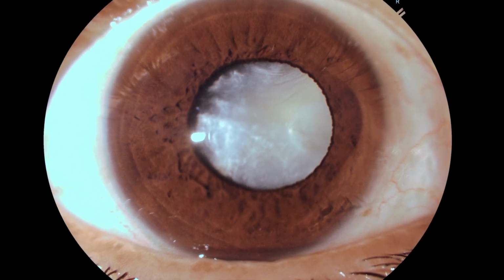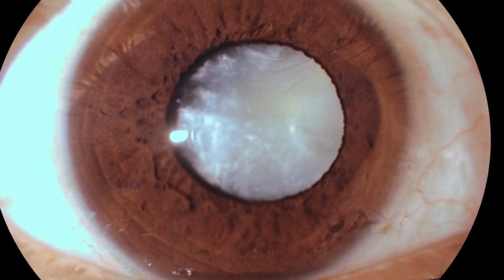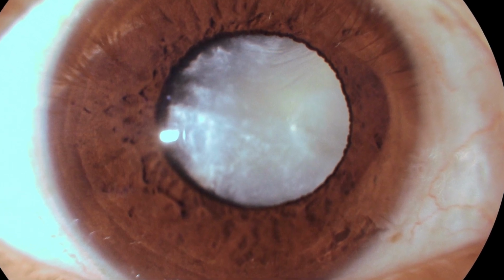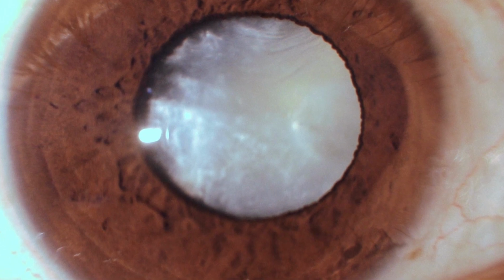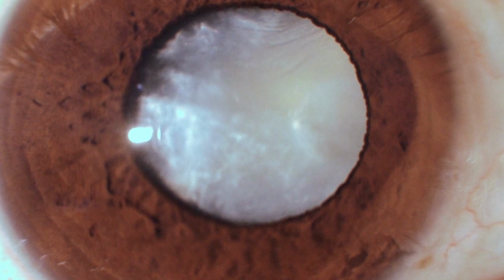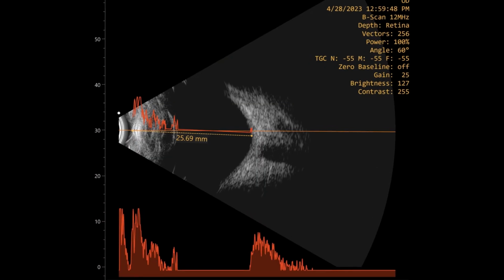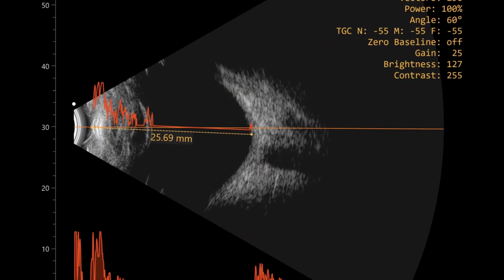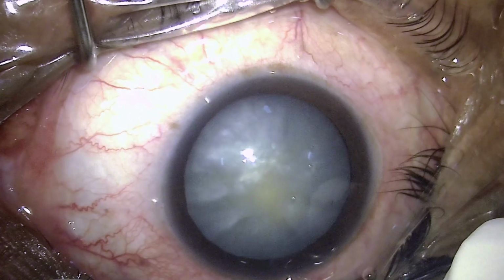At times, these white mature cataracts are intumescent kind of cataracts, and this is evident by the appearance where it is a variable color indicating that there are fluid lakes in between the opaque lens. Now this is one patient who had similar cataract, and this is the B scan which shows a nearly normal finding, and this is where we start.